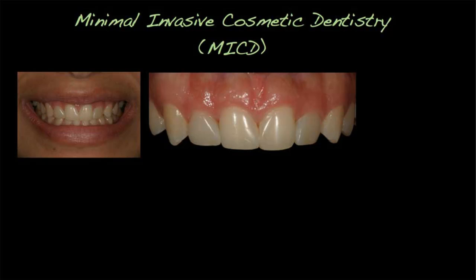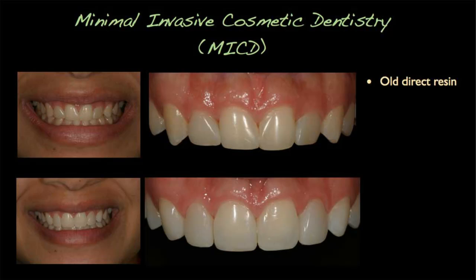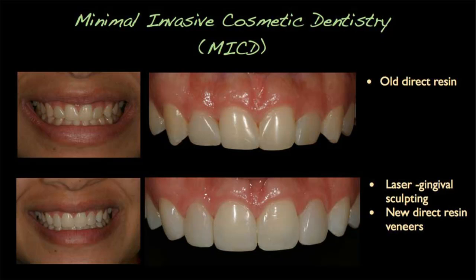But you can see here, using the opaque dentin and the technological advancements in composites, I'm able to close the spaces up and not have it look like there were spaces to begin with. You can see that. This case was done at the American Dental Association meeting, what we call Education in the Round. This Education in the Round is a live patient program, so I created this in real time. I did these 4 composite veneers in real time in 2.5 hours. So if I can do this in 2.5 hours, you can do it in 2.5 hours.